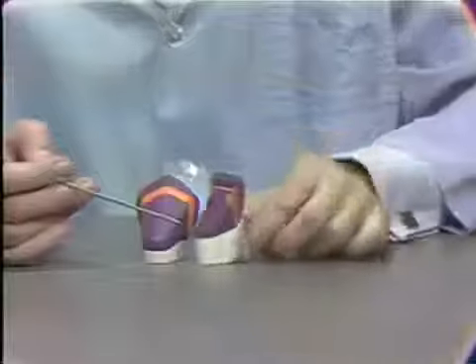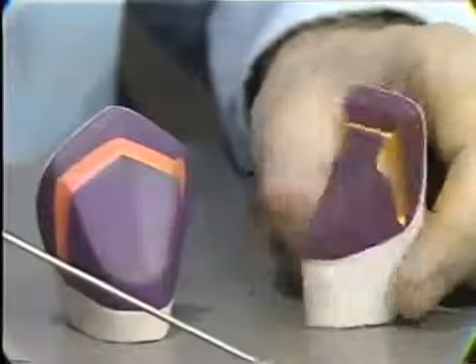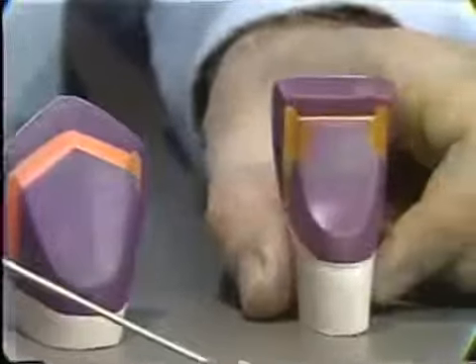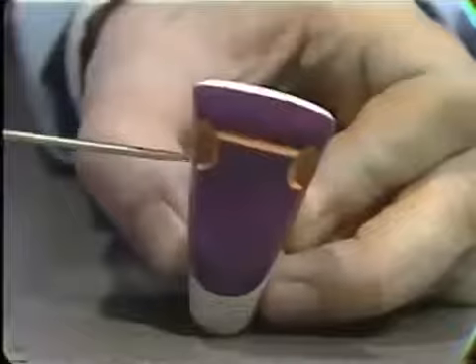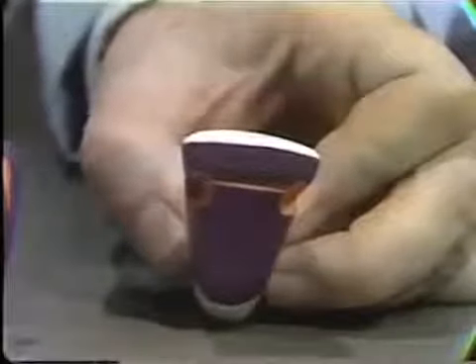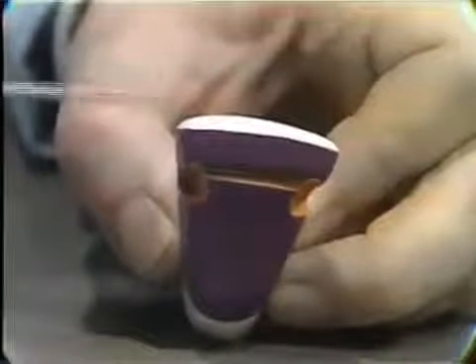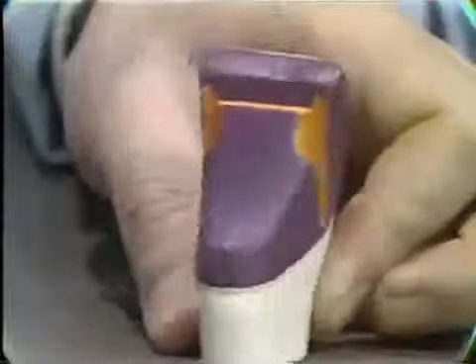The three-quarter crown varies a little bit according to the shape and character of the particular tooth. Here is one done on a mandibular incisor, which creates just a slightly different picture in the finished preparation. This particular one has grooves cut a little more extensively and made so as to be retentive in themselves. They're rather key-like, as I think you can see in that cross-section, so that they're additionally retentive from that point of view. But here again, this type of preparation would probably be replaced by a pin ledge in current practice.